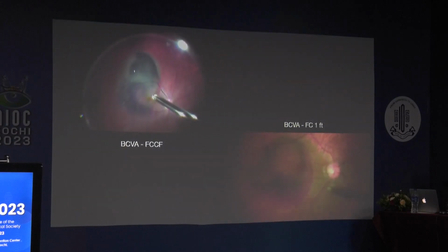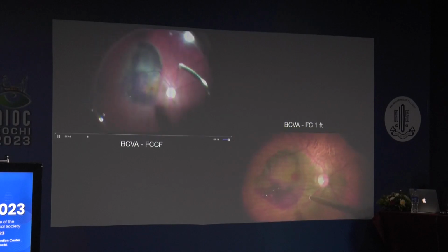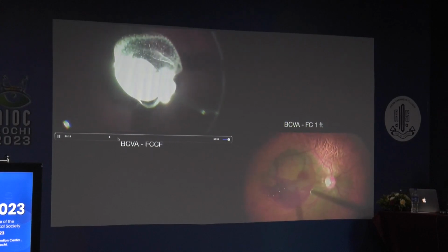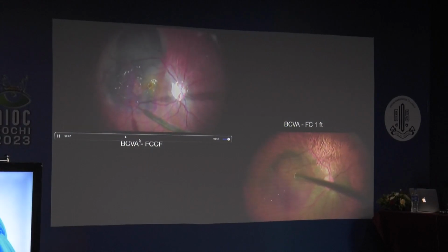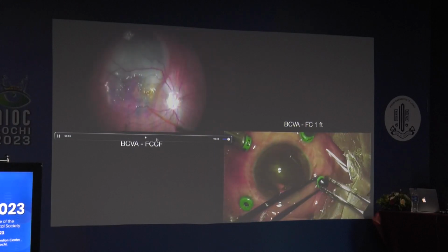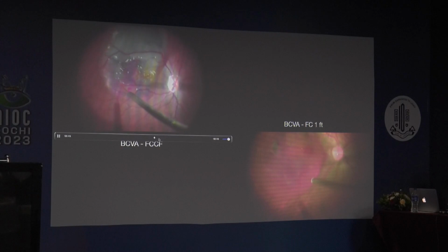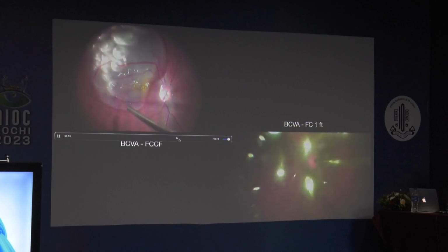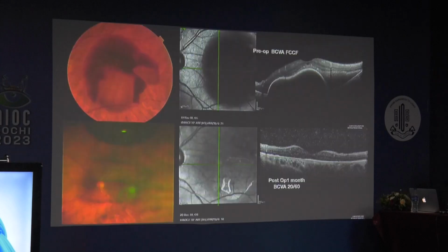The usual dose, I am restricting myself to less than 100 microgram, usually 50 microgram. Like in this case of submacular hemorrhage, after doing vitrectomy and PVD induction, using this subretinal polytip needle, I directly introduce it into the submacular space and wait for some time. Then after waiting 5-10 minutes, you inject anti-VEGF subretinally, followed by filtered sterile air, and finally do the fluid exchange and SF6 gas tamponade.